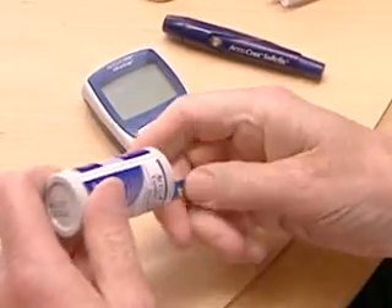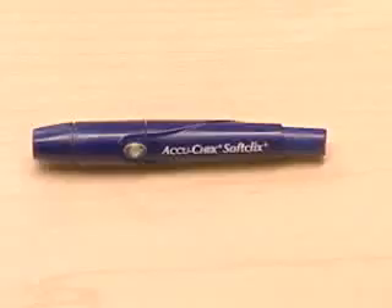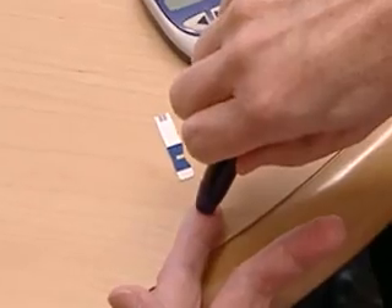Although blood glucose meters are fairly simple to operate, many things can go wrong if the user isn't careful. Here are some tips that can help people with diabetes get accurate results from their glucose meters.